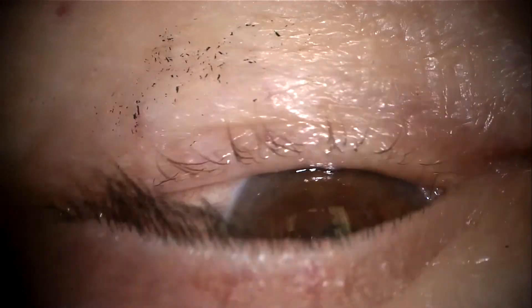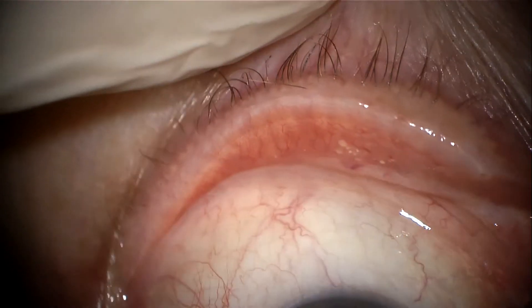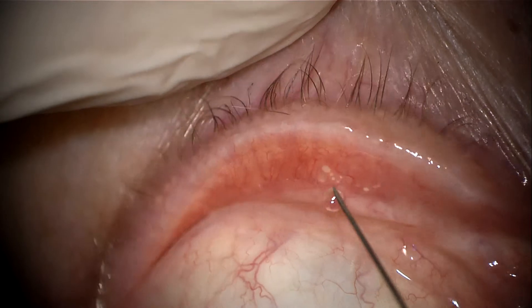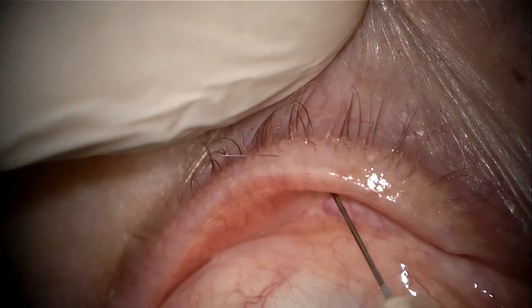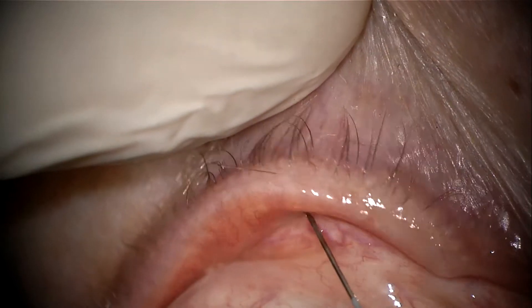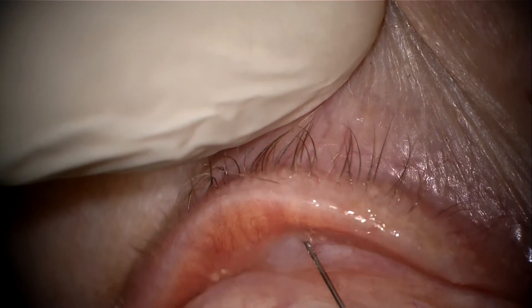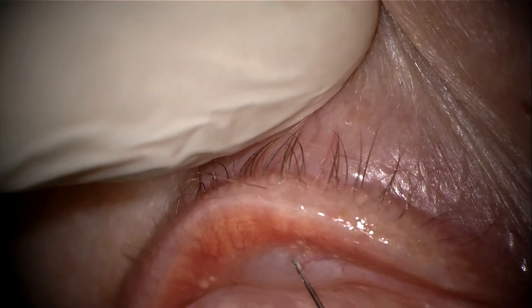I often mark the offending eyelashes; however, in this case there is just a single eyelash which has not been marked. Following installation of topical tetracaine 0.5%, I prefer a transconjunctival route first for local anesthetic to reduce discomfort for the patient. I also use articaine 4% with epinephrine for the same purpose to reduce discomfort.